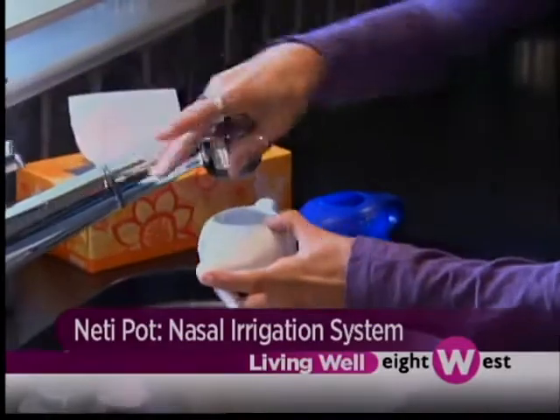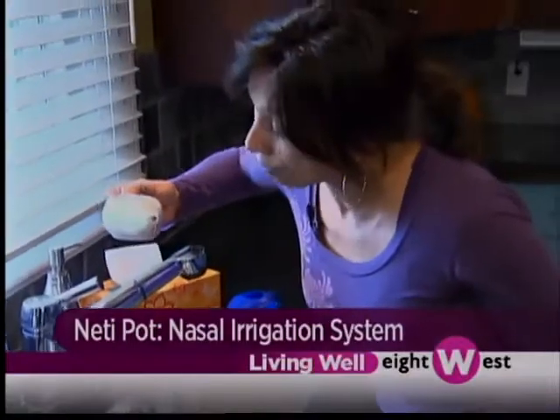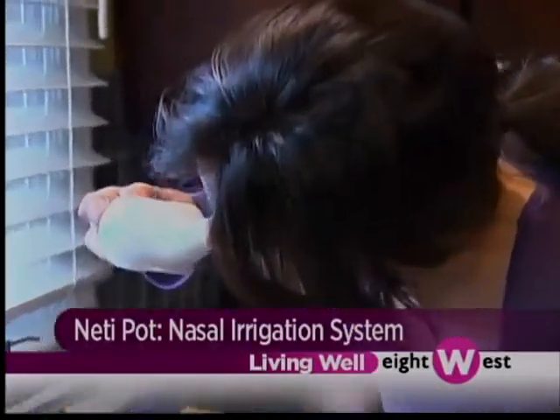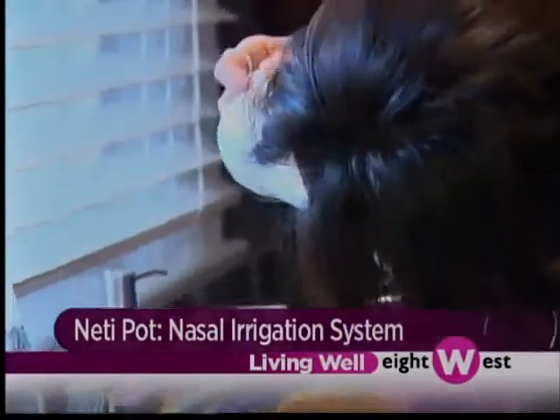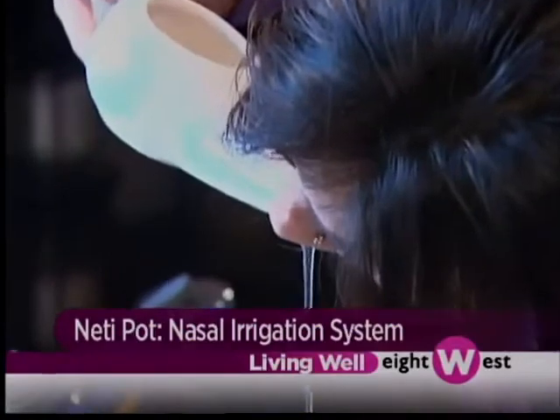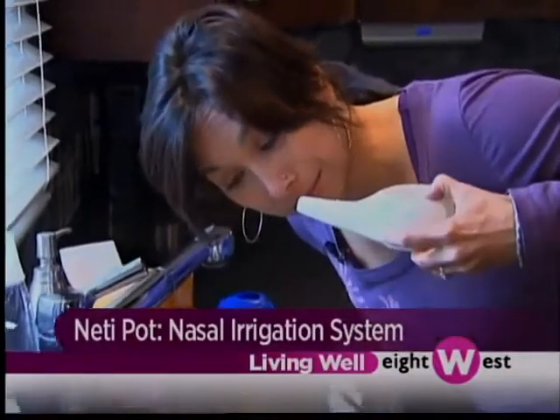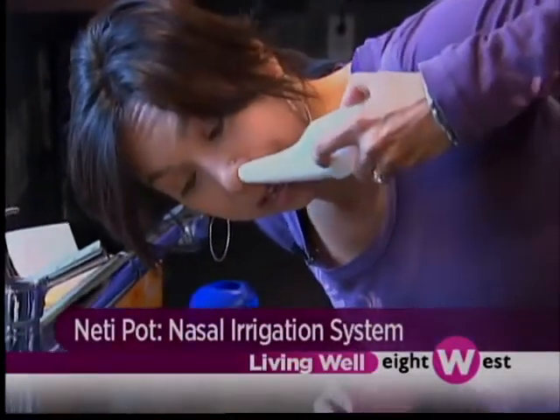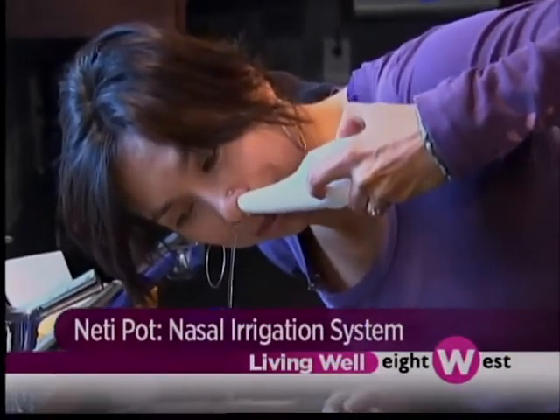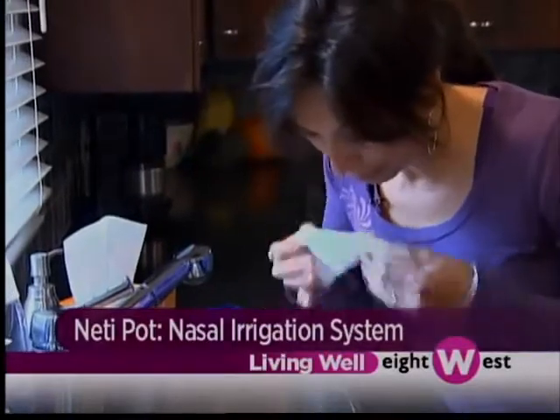Kind of mix it up a little bit so that you have the salt. I'm going to use my finger for mine because it's mine, but I won't stick my finger in Matt's. And I'm going to put it in my dominant nostril first, just the one that feels more airflow, and for me that's my right. Breathe through the mouth. And that goes up around through your nasal cavity and cleans out the whole passages using the sea salt. The second side. And the idea is that it flushes everything out.